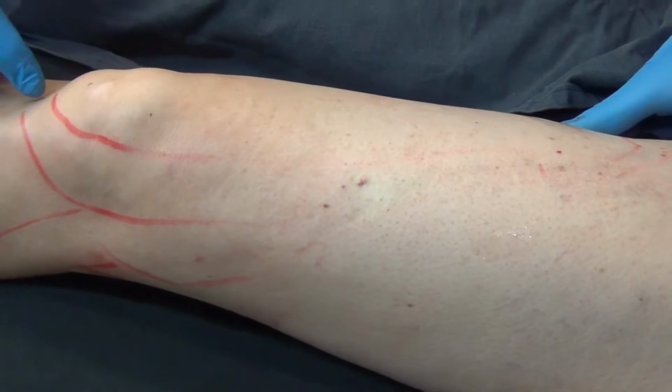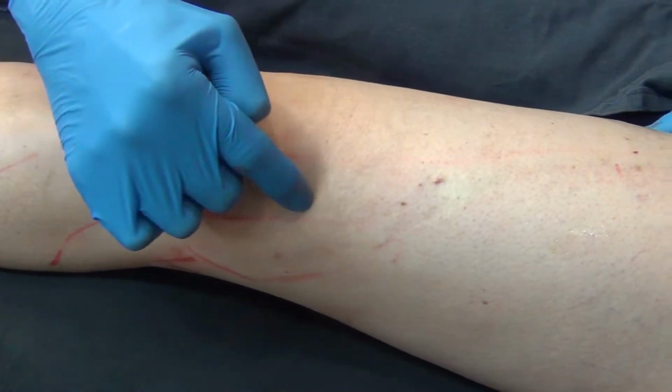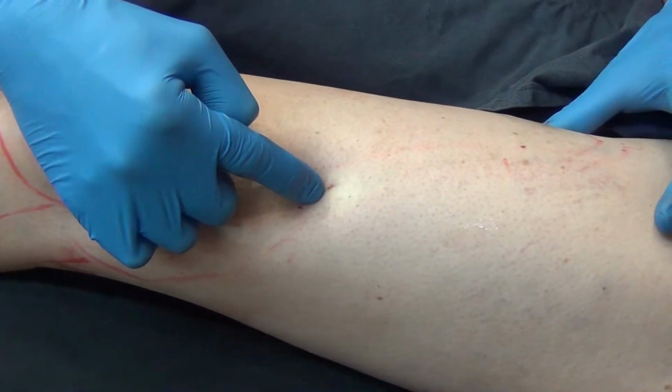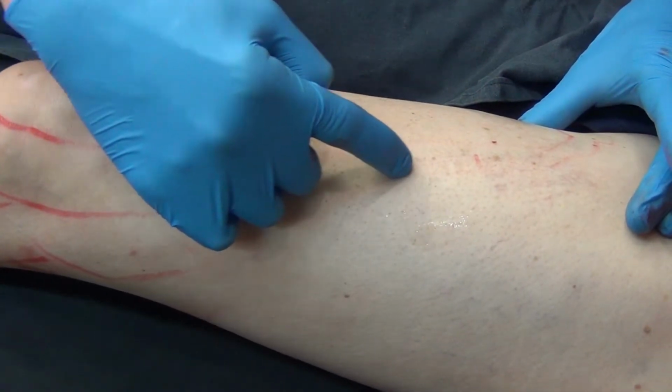Our abnormal circulation came from a perigenicular branch through a lateral cutaneous. We entered here with the intracath, which is now suture closed with the 5-0 monocrystal suture. The varicose vein itself has been closed.